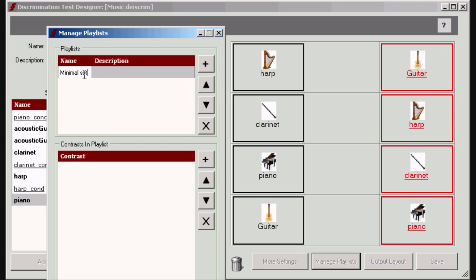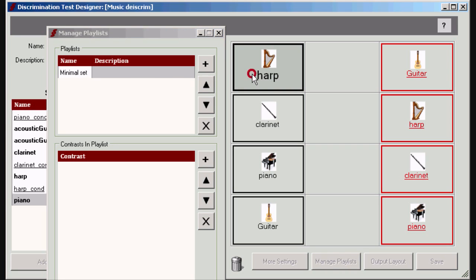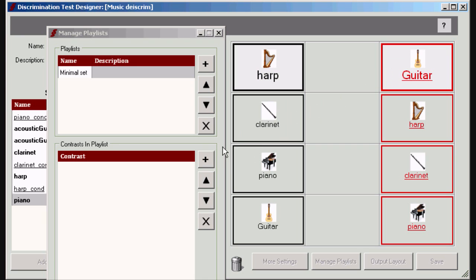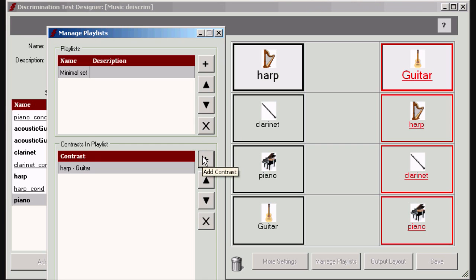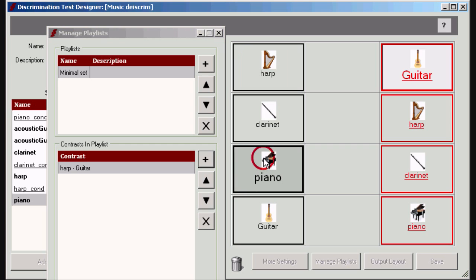Then define the first contrast by selecting a background sound and a stimulus sound. Add this contrast to the list. Now select a second contrast.